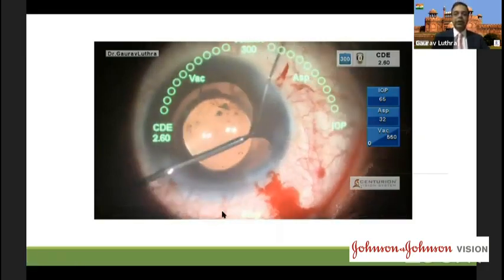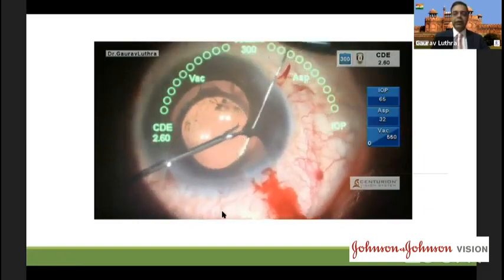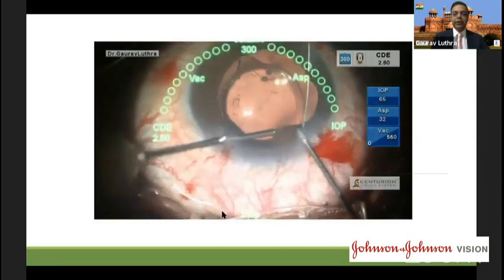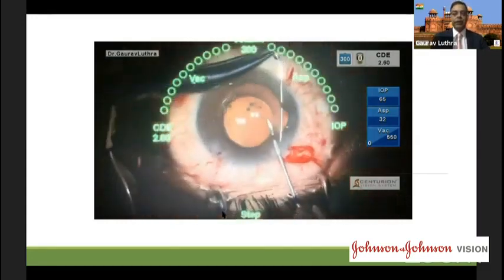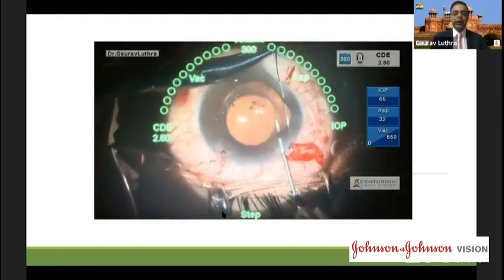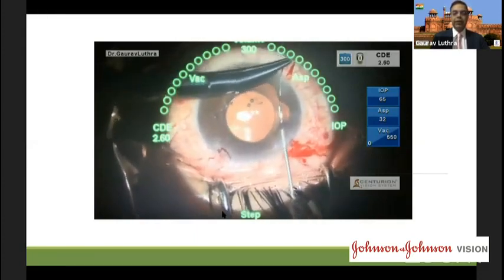You can actually just go in straight with the 10-0 Prolene needle through the cornea, because you don't really need a port there. But to come out, you can use a second needle, the 26 gauge bent needle through a paracentesis, and then hold the iris. Now the key is to hold the iris with one of these nice forceps. I'm using the MST micrograspers, but you can use almost any good iris holding forceps, which are less traumatic. The trick is to get a bite which is sufficient, and it is right at the place where you want to put in the suture.